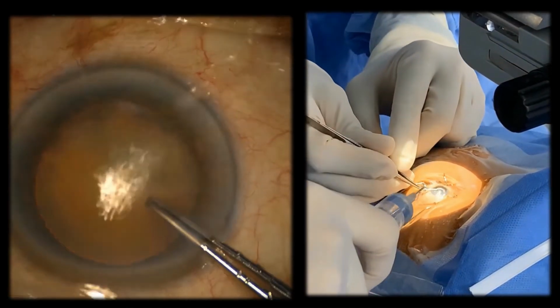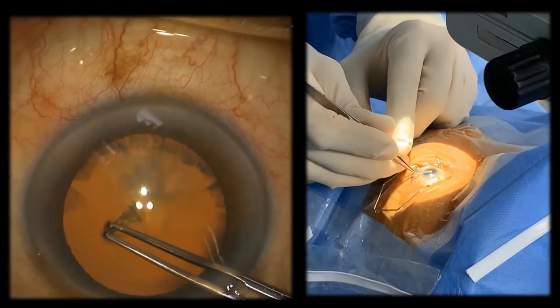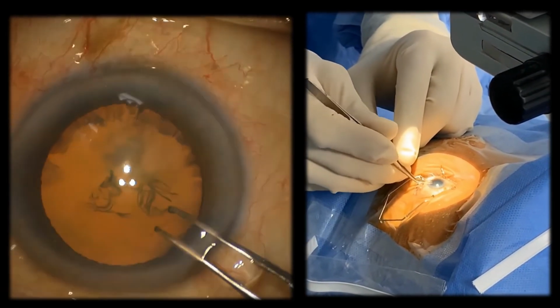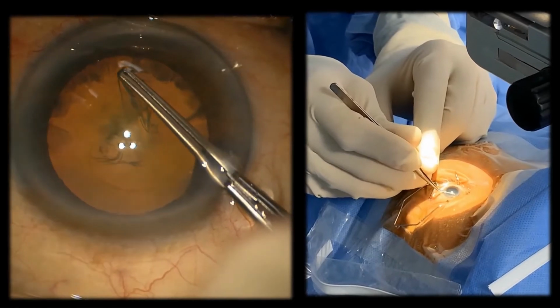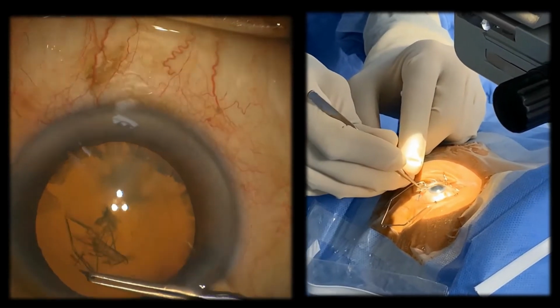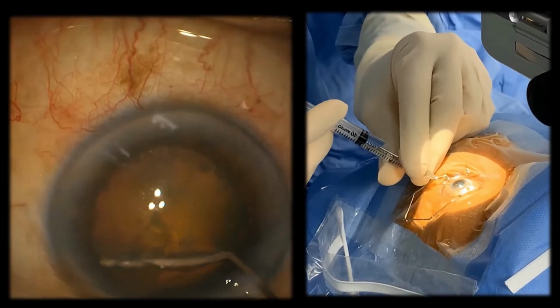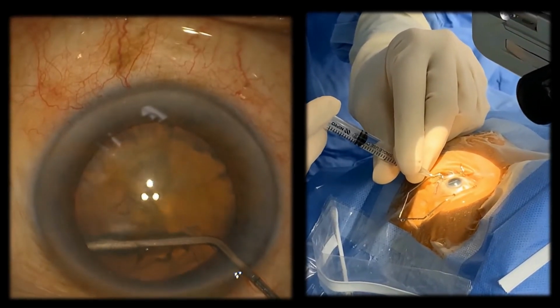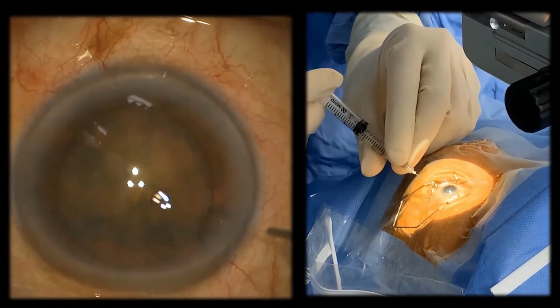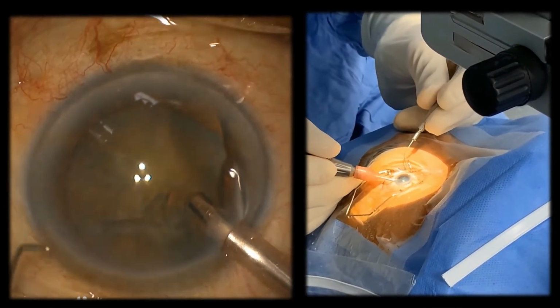After injection of the cohesive viscoelastic, a 5 mm capsulorhexis is made using the intraocular forceps. I prefer to use the forceps and step directly onto the anterior capsule and raise a flap, and using the forceps I can control the pulling of the anterior capsule. Hydrodissection is then made, making sure that the nucleus is rotated to facilitate the phaco.